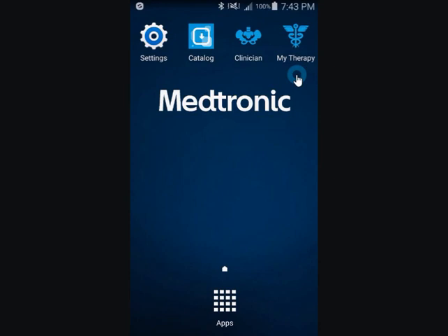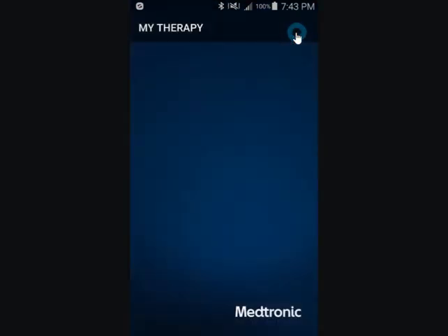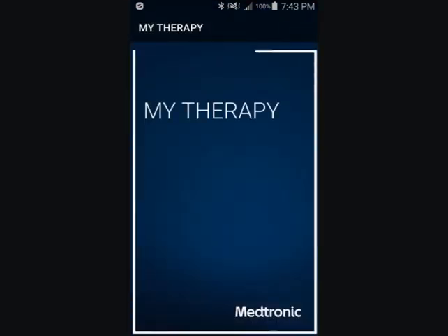From the main screen, click the MyTherapy app. If this is the first time the MyTherapy app is accessed, then the patient tutorial video plays.